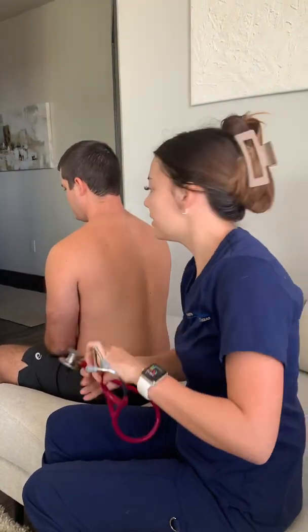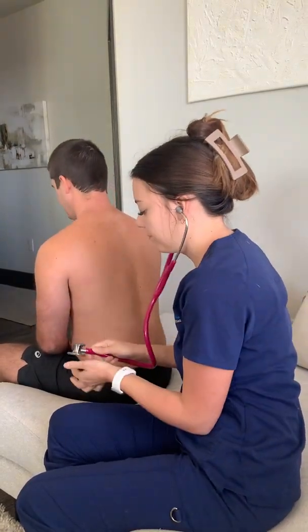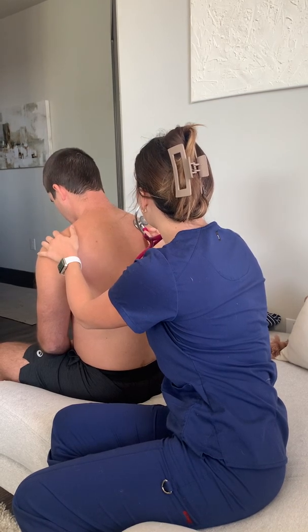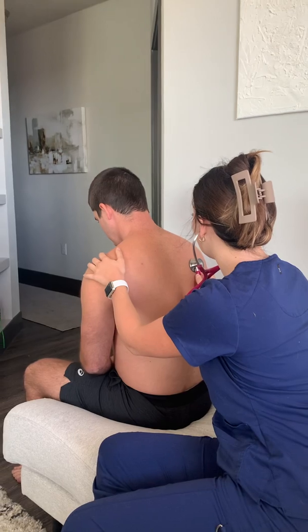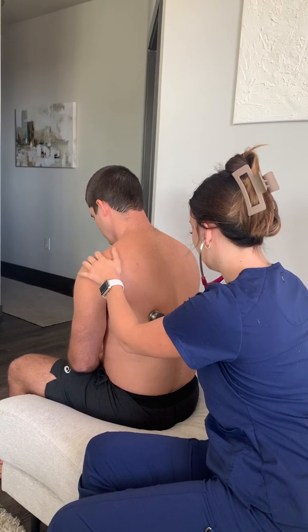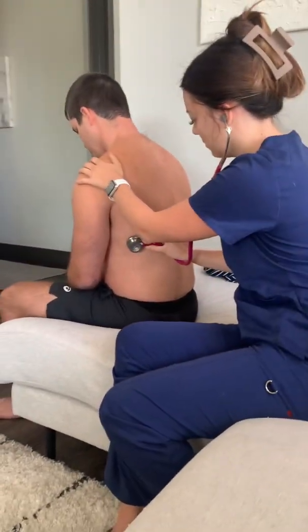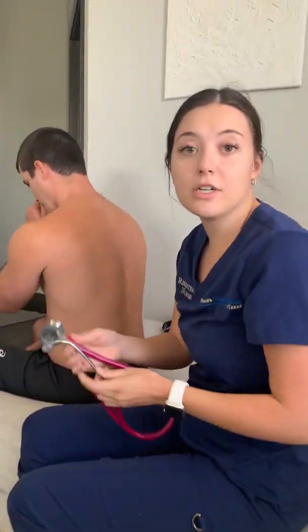So I'm going to listen now and auscultate the various lobes on his posterior chest and listen for any adventitious lung sounds, okay? I'm going to use the diaphragm of my stethoscope. So just take a deep breath. And again. Great, his lungs sounded clear to all lobes bilaterally. I didn't hear any wheezes, rhonchi, rales, nothing like that.